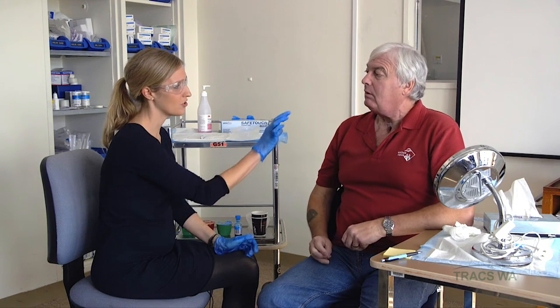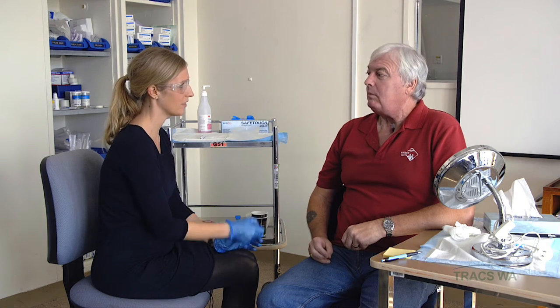We might just review how you're cleaning your valve, okay? What do you do each day to clean your valve and your stoma? Well, I get the brush and I clean the centre and sometimes I have to clear away some harder bits with a tweezer. Okay, so if there's any dried mucus, you're plucking it away just as needed, yeah? And how many times a day do you clean your stoma and your valve? Well, certainly first thing in the morning and last thing at night and during the day when I feel it needs to be done.